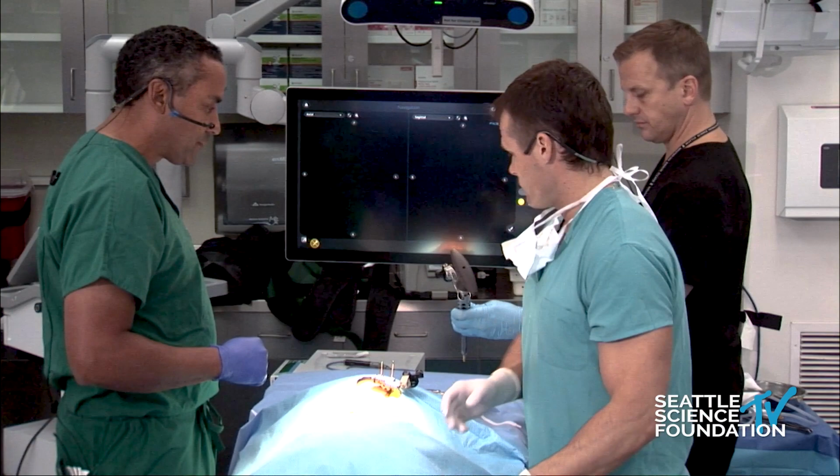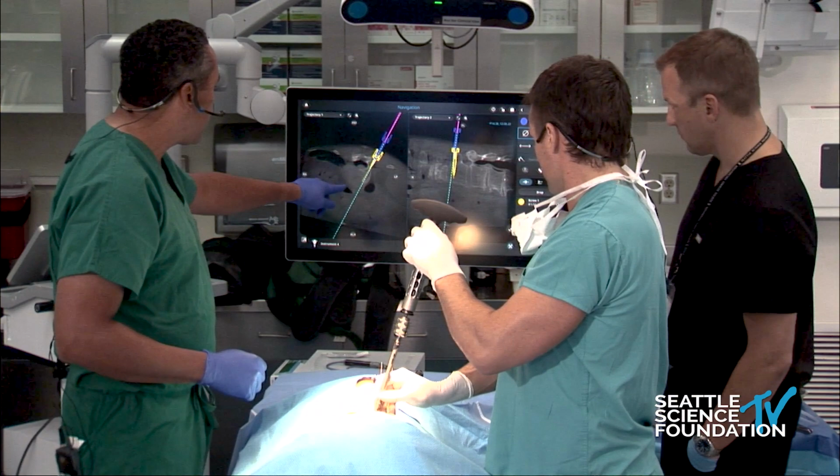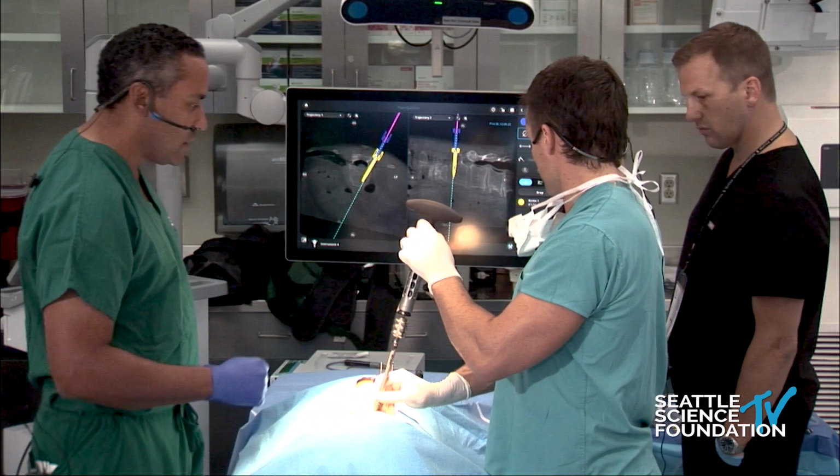Okay, this has to face towards the camera. We want the screw to be blue. So you're just going to line the blue up with the... so that's not right. It's that one. Okay, so see how you're just slightly high? Yep, there you go. Now just start putting in the screw.